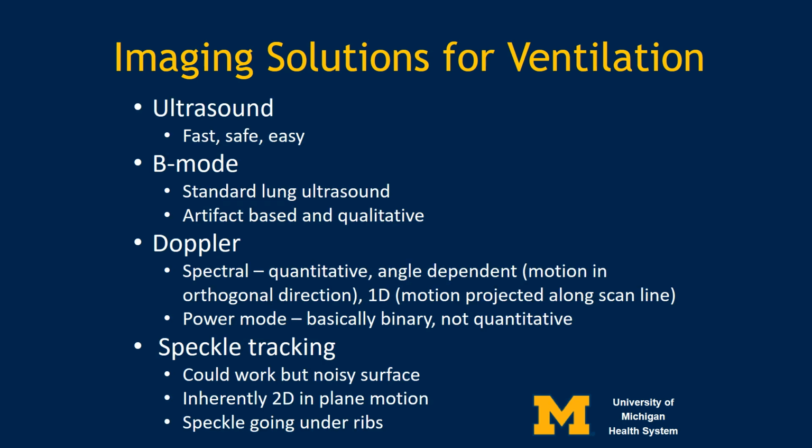So ultrasound is another option for evaluating ventilation. Ultrasound is fast, safe, and easy, and B-mode ultrasound is being used a lot for evaluating lung pathology. However, this is based on artifacts and is qualitative.